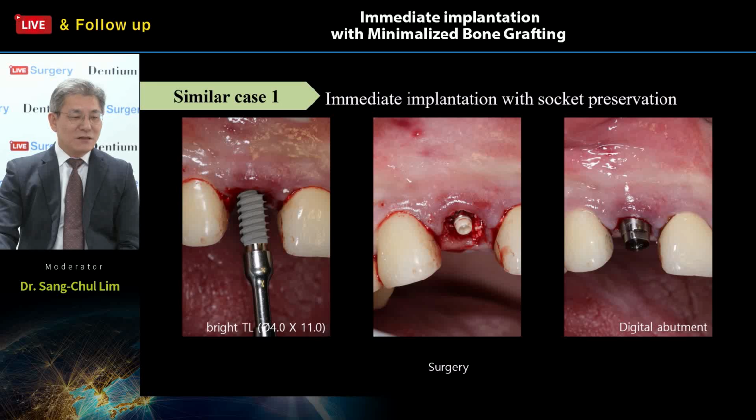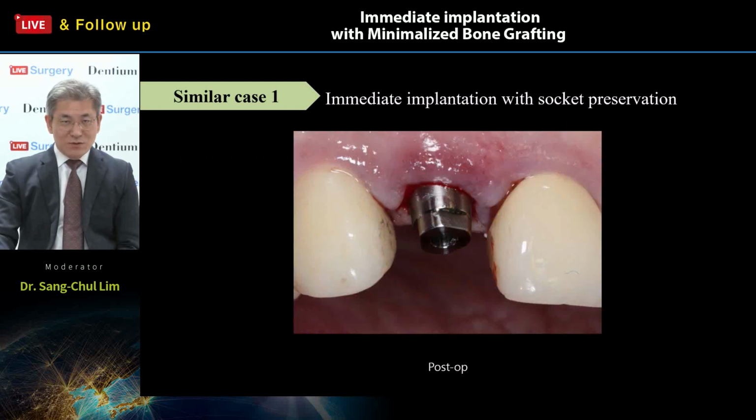And after that, we connect the digital scan abutment for intraoral scanning for a temporary PMMA or temporary prosthesis. This scan abutment is very versatile. Sometimes we use it as a healing abutment, and also as a scan abutment. Sometimes we use a temporary abutment for the temporary prosthesis, like a dual abutment of the Supine system. For this purpose, this scan abutment should be longer than this one.